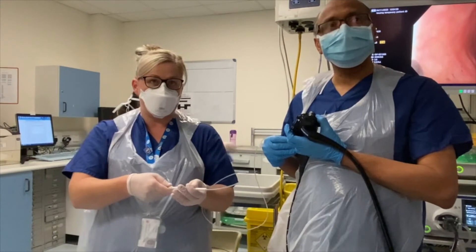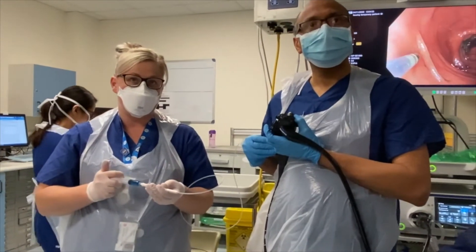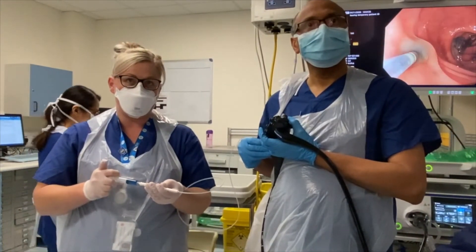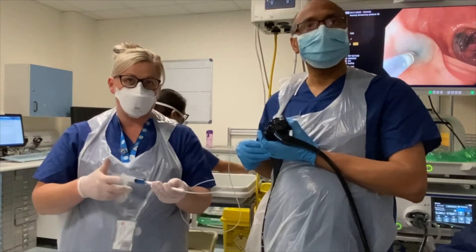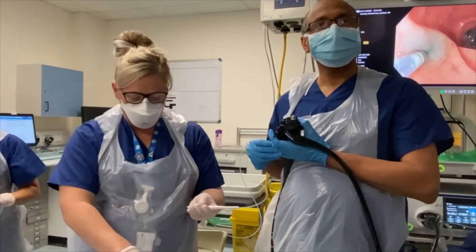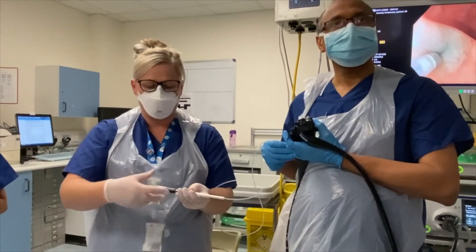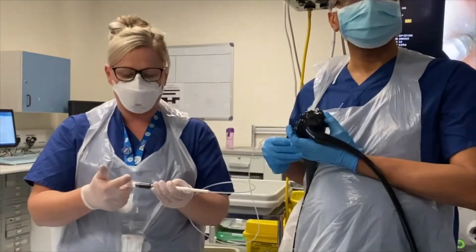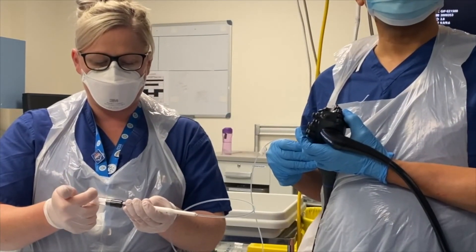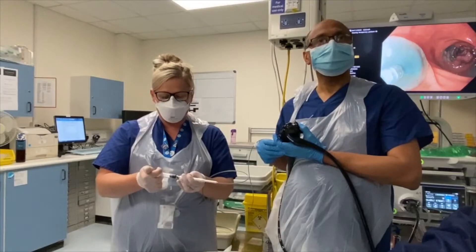Needle out. Inject. Inject — inject 10. Stop. Change to tattoo. Inject — inject 10. Inject 10. Inject 10. And change to tattoo.